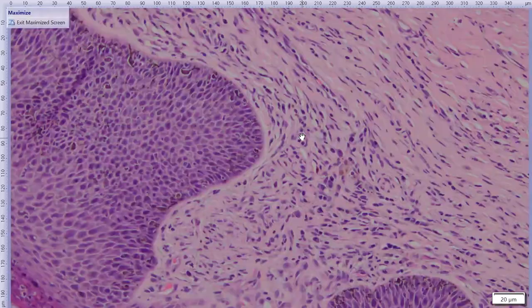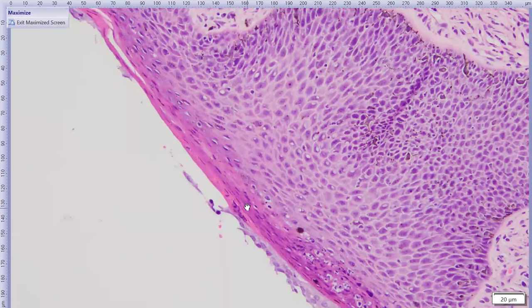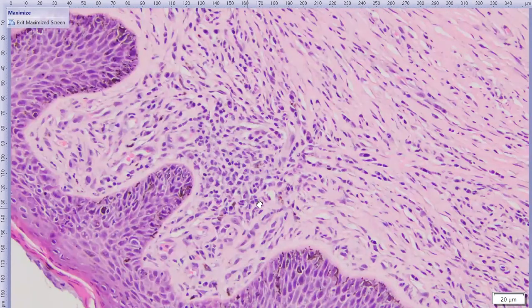And as we get closer, it is pigmented. You can see some of that brown pigment in these cells. And also it is nicely keratinized. So we've definitely got epidermalization of this corneal epithelium as well. And then the superficial stroma is vascularized. It is fibrotic, a little bit disorganized, and infiltrated by lymphocytes, plasma cells. And there are some melanin-laden macrophages in here, which go along with the epithelial pigmentation.